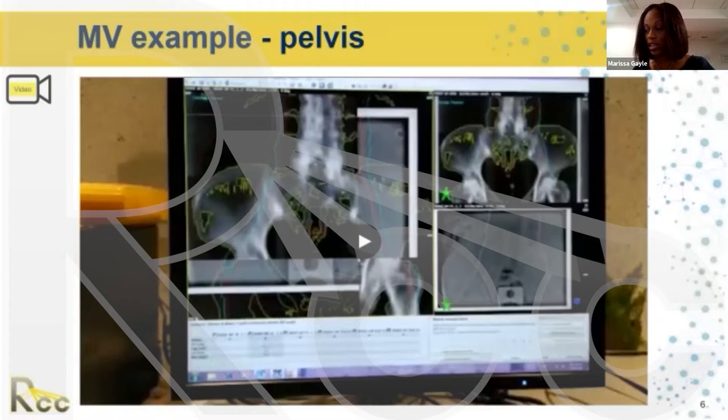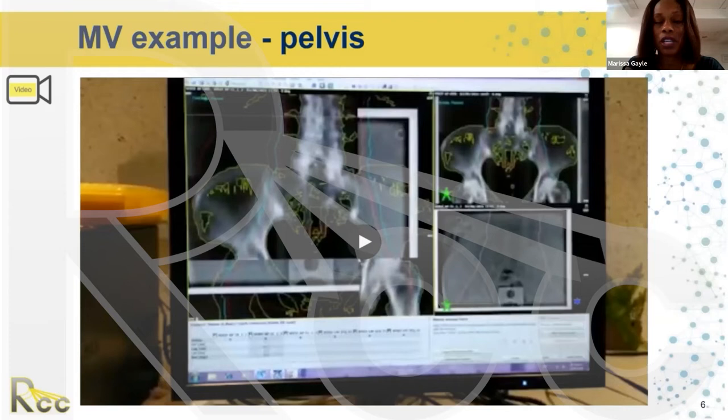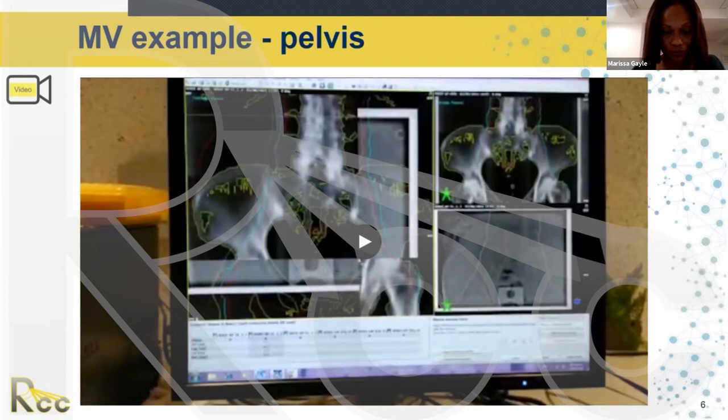The next film example is of a pelvis — a female pelvis — and this image came from Victoria Lopez. With female pelvis, especially if you have to include the paraaortic region, it's very important to have not only the pelvis bony anatomy match, but also the spine, because there are a lot of nodal involvement that we could miss if the spine is not aligned.